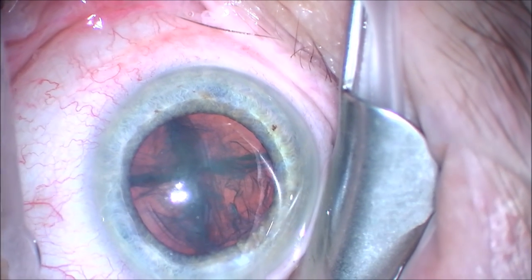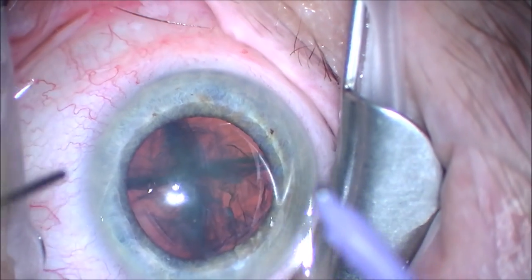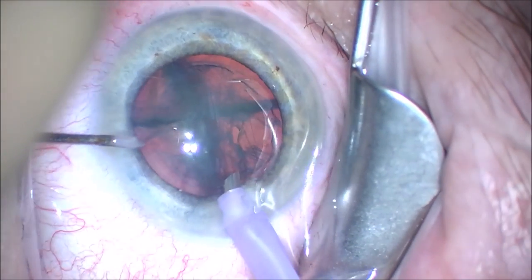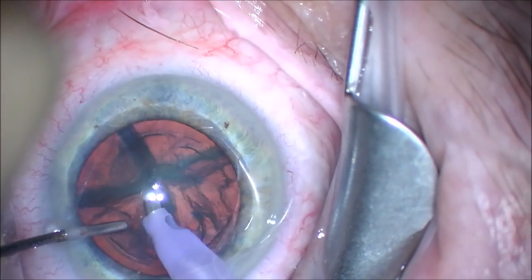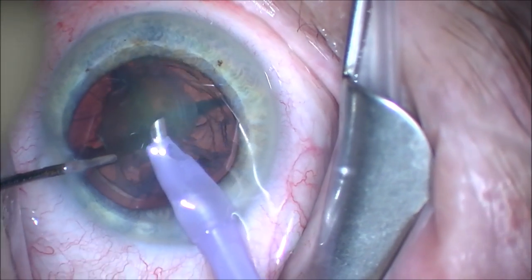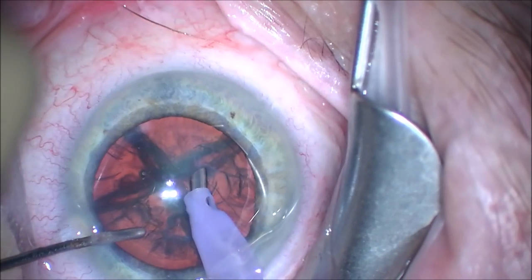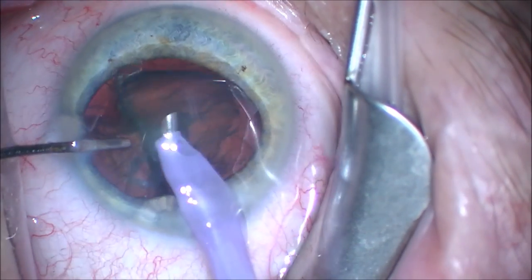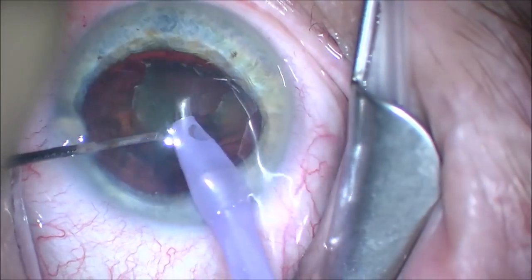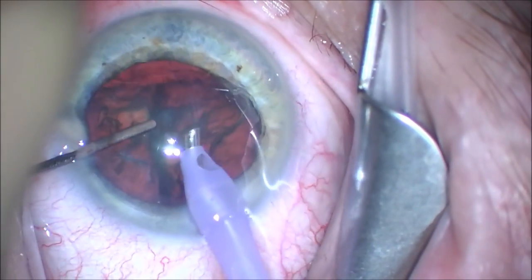We're going to use the Alcon Centurion phacoemulsification machine in this case and remove each of the pieces of the cataract with burst mode. This will use little bursts of ultrasound energy to grab the piece of the cataract, as you can see there. Then it will be sucked up into that tube in the phacoemulsifier and broken into little pieces. You can see we've taken the second piece out very quickly.